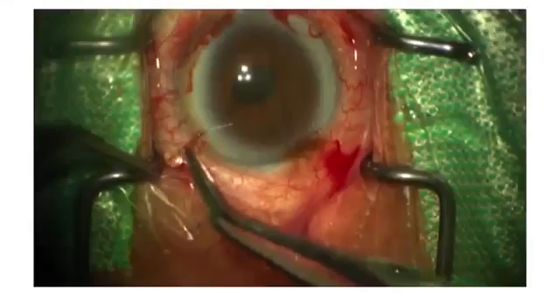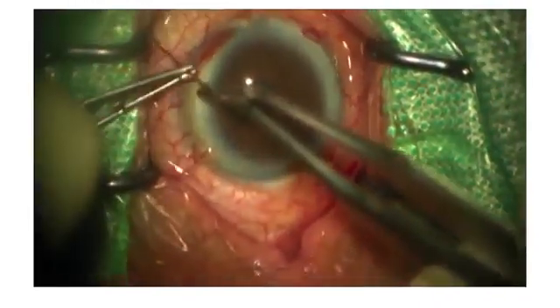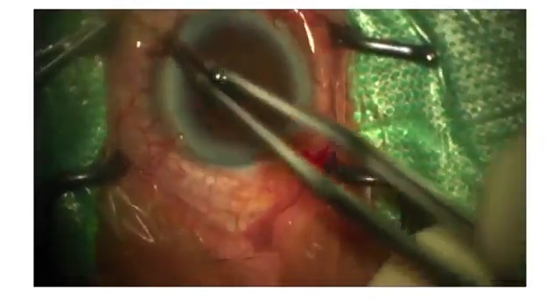to open the capsulorhexis, because the membrane can be thick and can be different in many parts of the anterior capsule. Another device that's very helpful is the iris hook. You can use iris hooks to open the pupil up. Three or four iris hooks is very helpful.